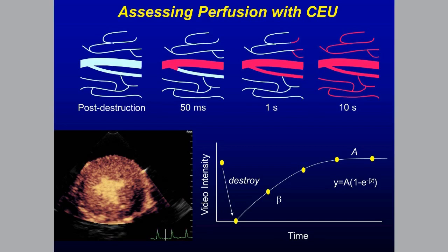So for the near term, at least, until we can control these things, most perfusion imaging really should be done with 2D transducers, where signal to noise is optimal and multi-pulse algorithms are used to increase signal to noise ratio, which would be kind of a disaster with 3D probes. So hopefully I answered that one. If there are any other questions, please just type in a subsequent question.